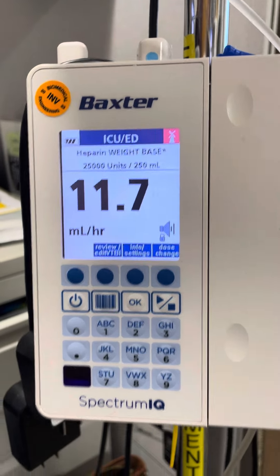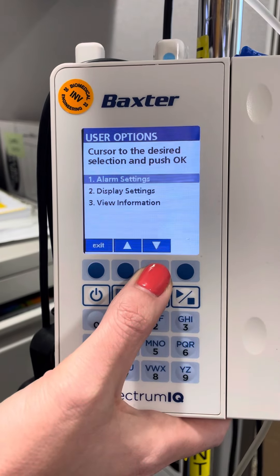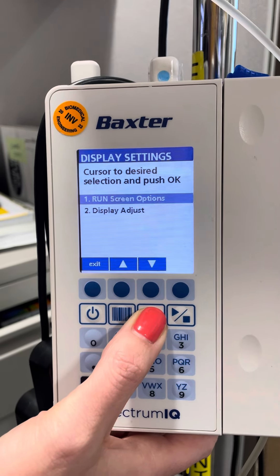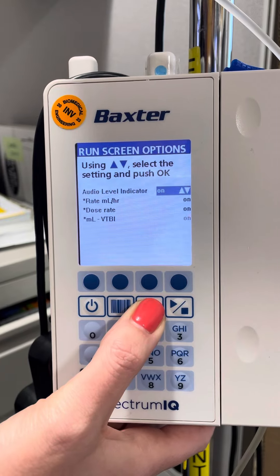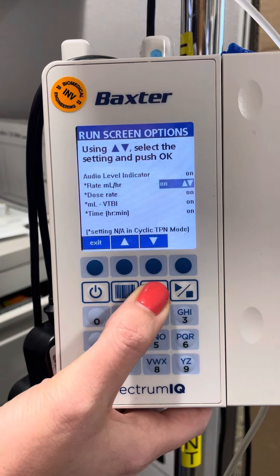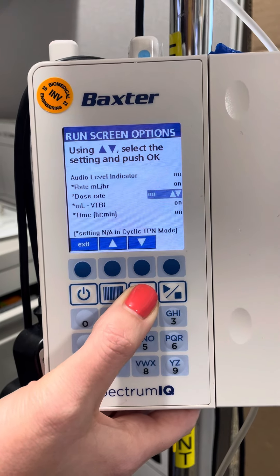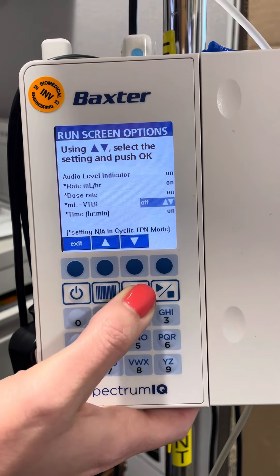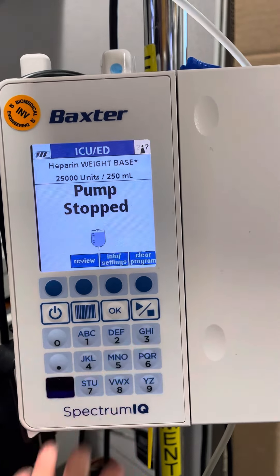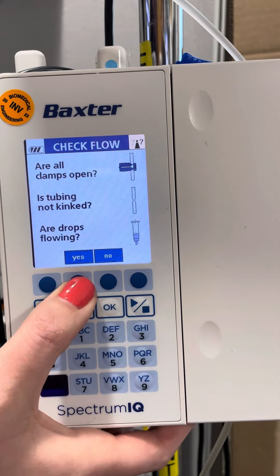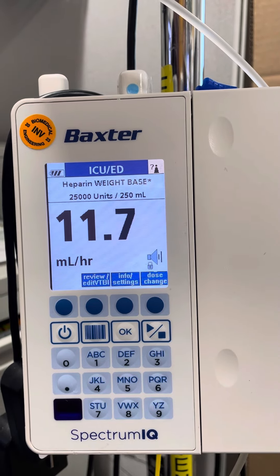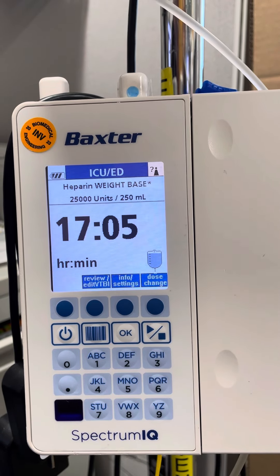You can hit Info, Settings, down to Display Settings, Run Screen Options, and then you'll see each screen you can turn on or off based on what you want to scroll through. If we turned off volume to be infused and off time left for the infusion, you can see that now there's much less scrolling — you're just seeing the dose and the milliliters per hour.